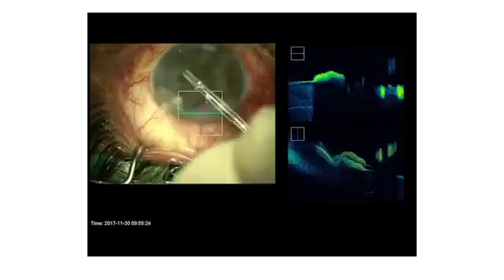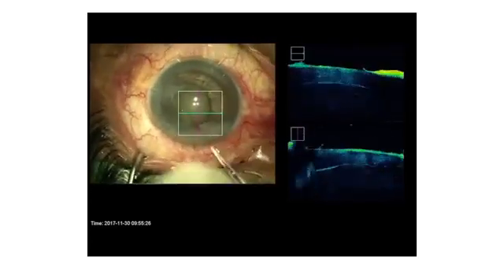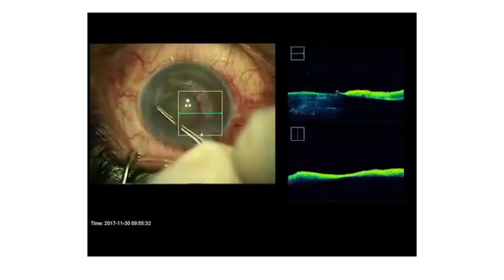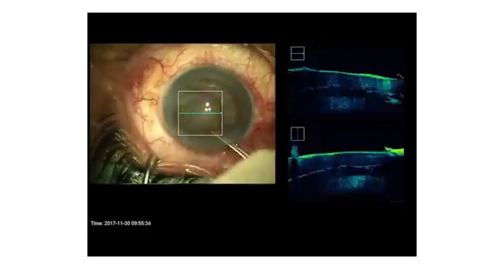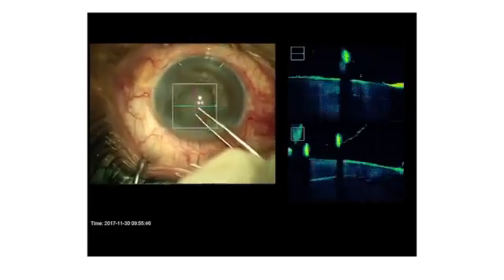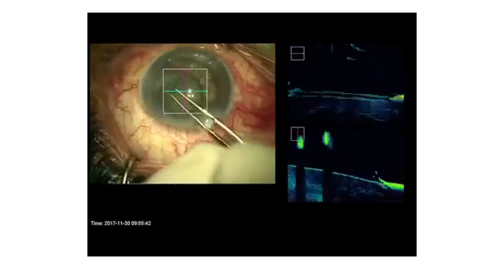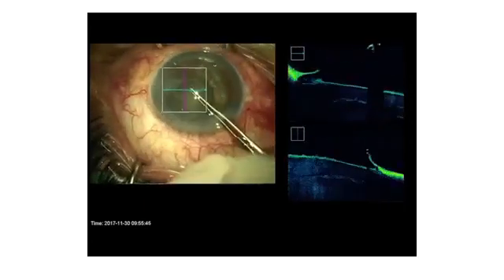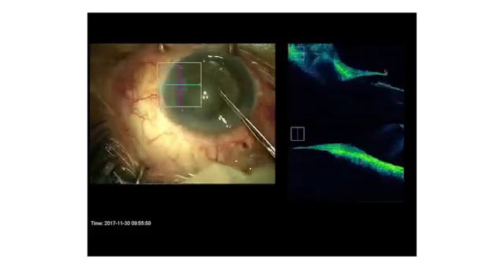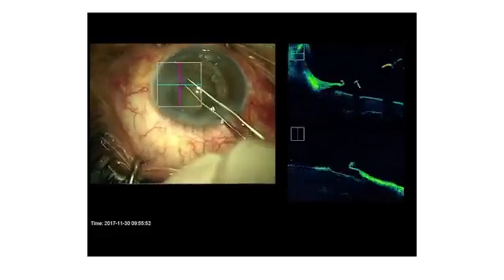The membrane is very thick, and sometimes when you remove a very thick membrane, you need to emphasize that too much stretching can be harmful. It can cause not only bleeding from the iris and from the pupillary margin, but sometimes it can even cause iridodialysis and cause a lot of trauma and bleeding from the anterior chamber angle.